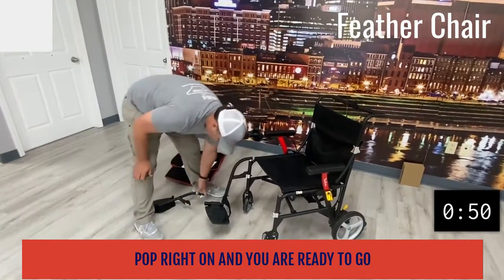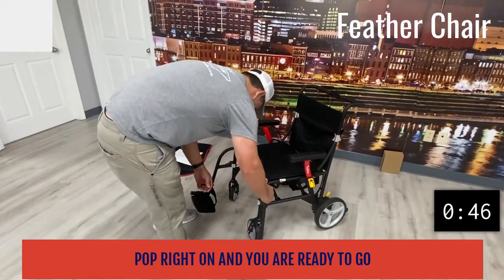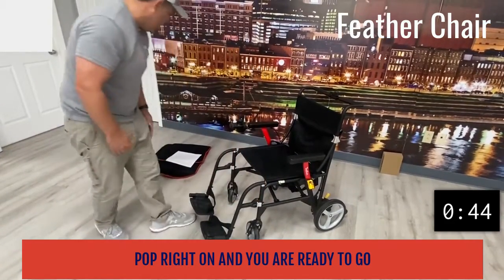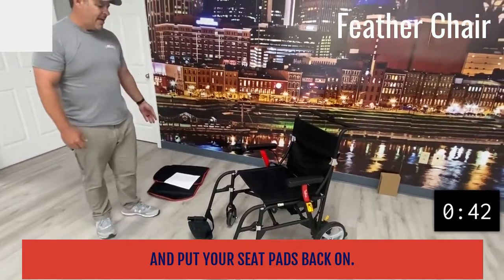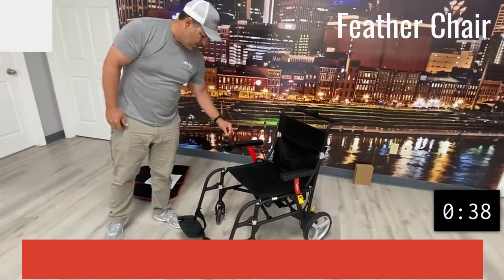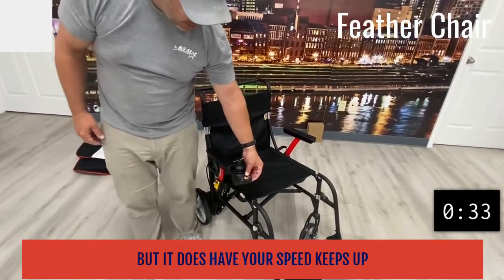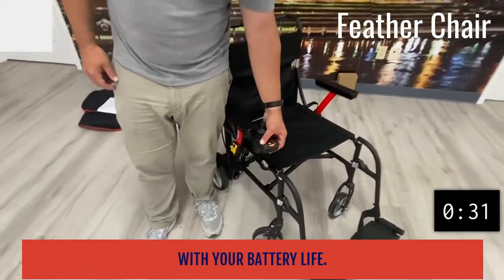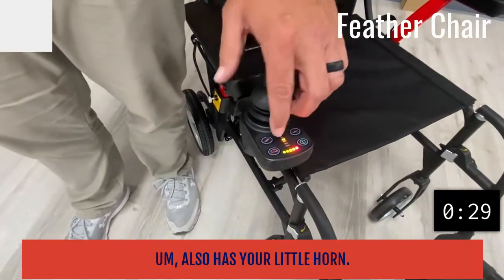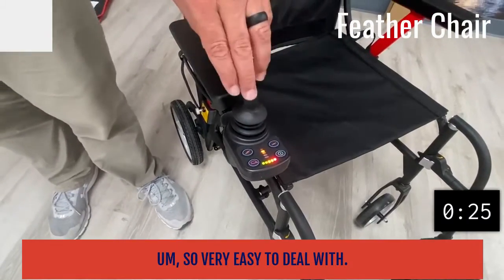You put your seat pads back on. There's a small joystick here which is standard on power wheelchairs — it's a little more compact, but it does have your speed control, keeps up with your battery life, and also has a little horn. Very easy to deal with — it's a great chair.